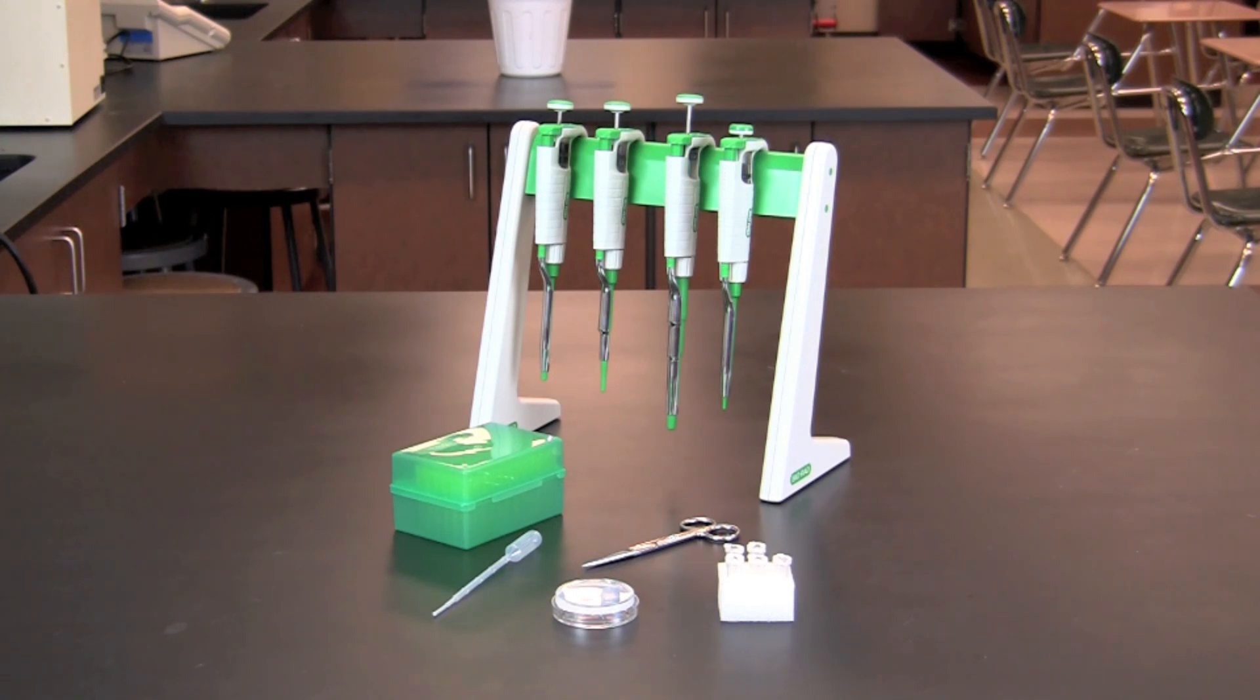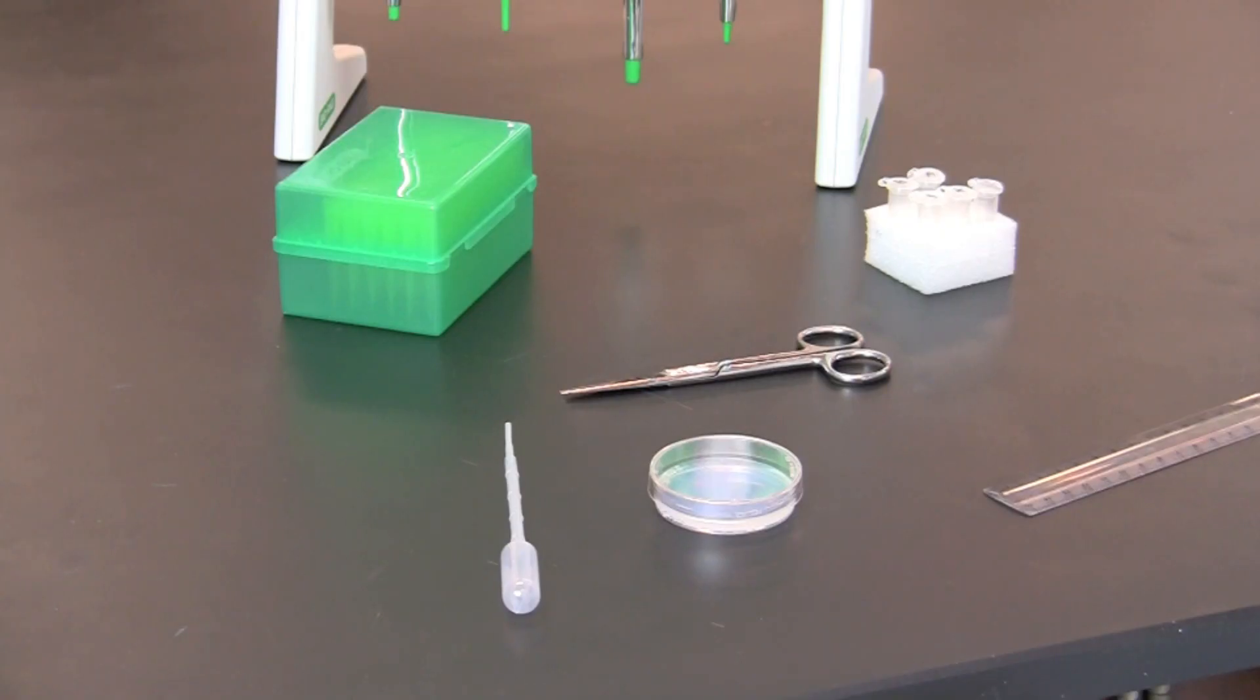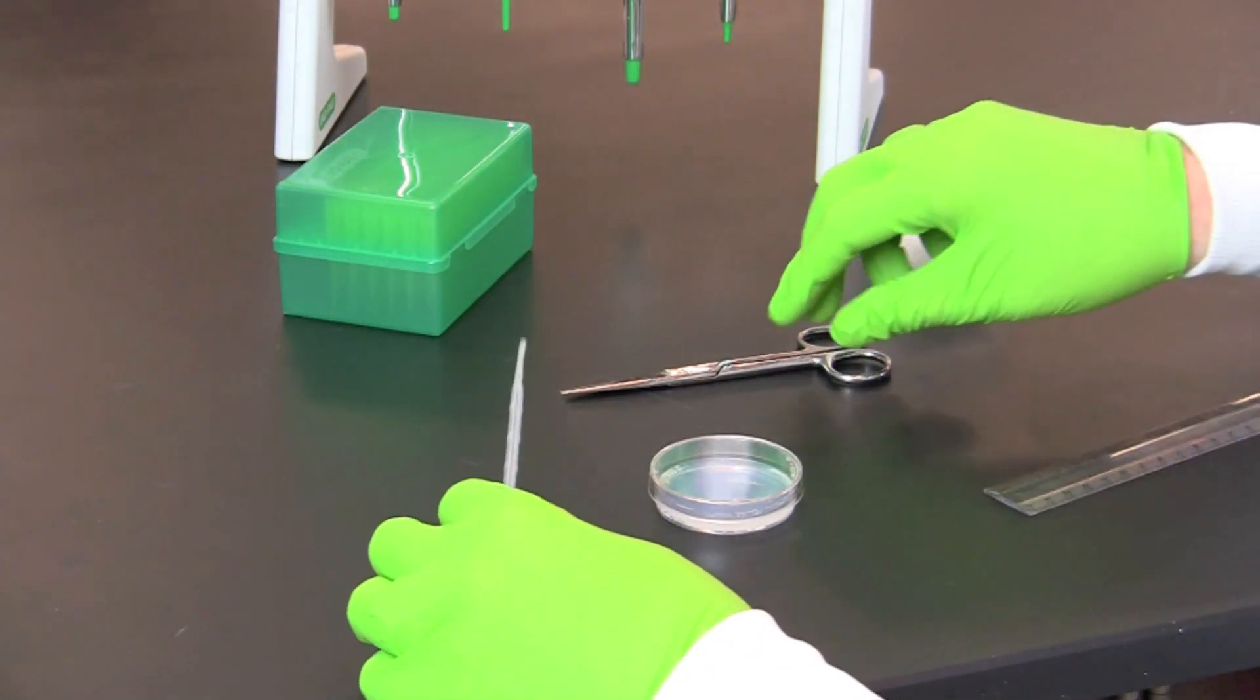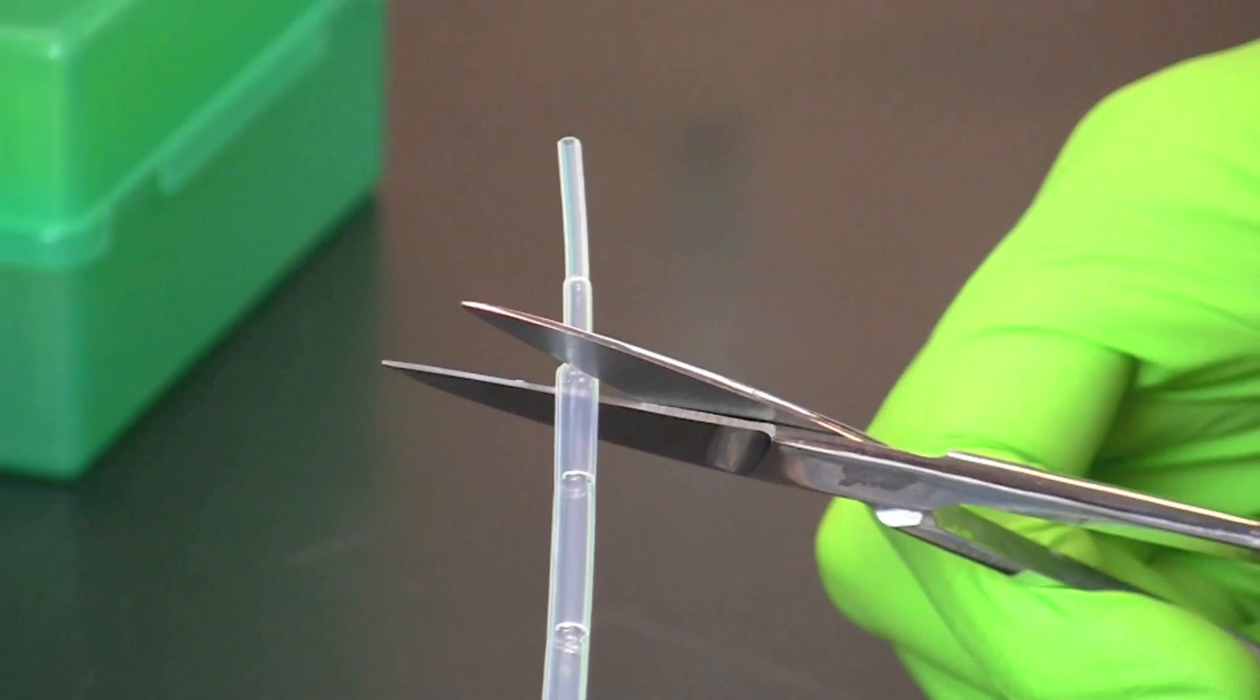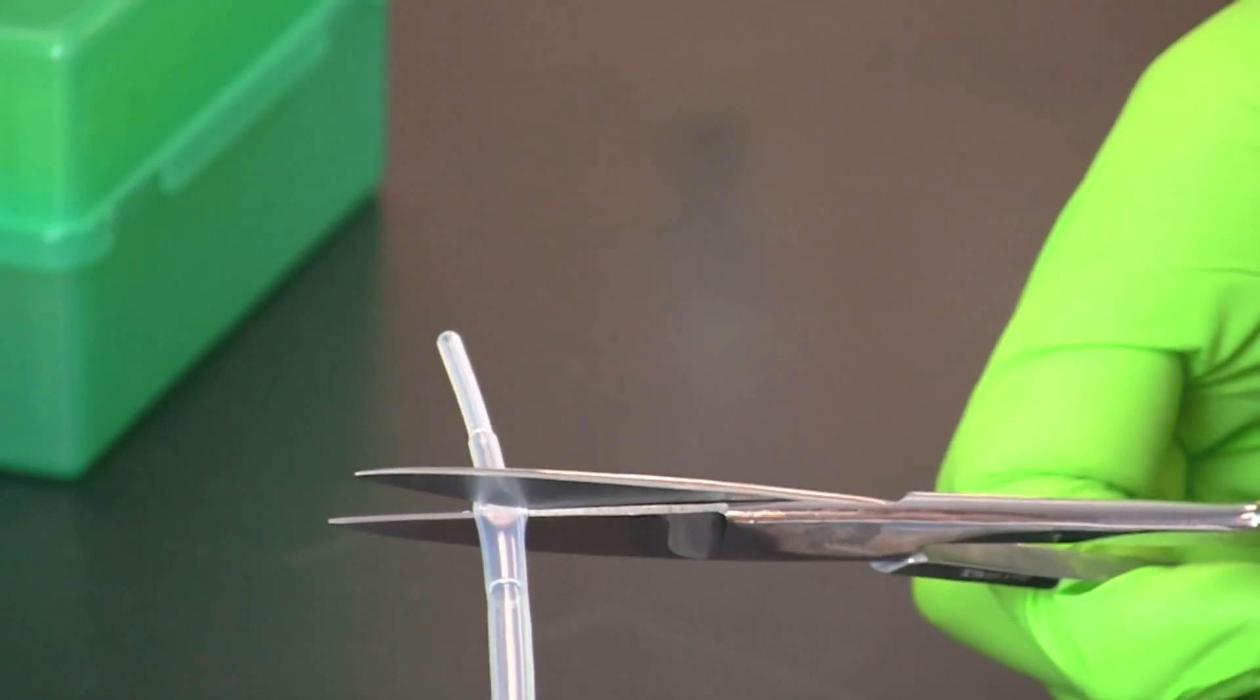In this video you will learn how to perform an Ouchterlony assay. Using scissors or razor blade, cut off the end of a 1 milliliter transfer pipette between the 250 microliter and the 100 microliter marks.